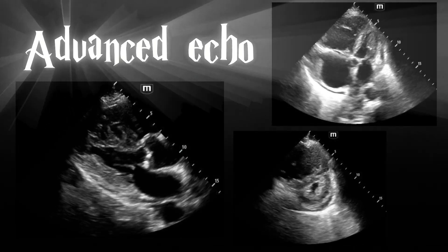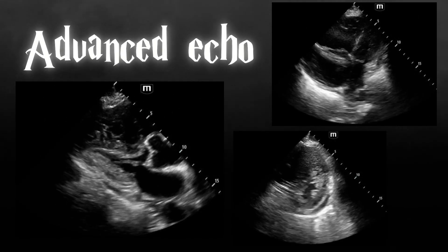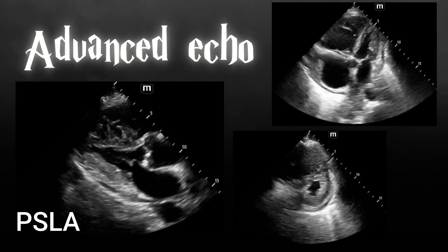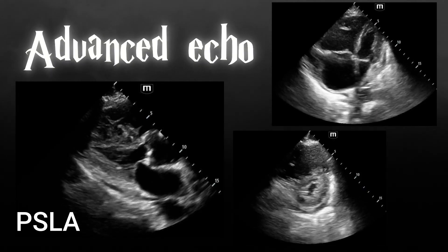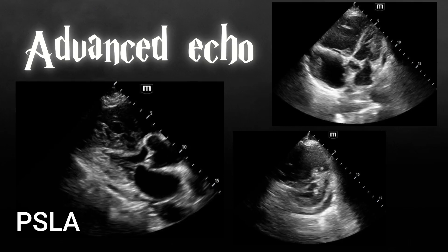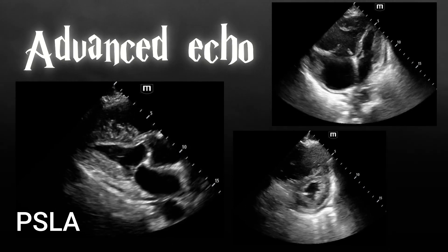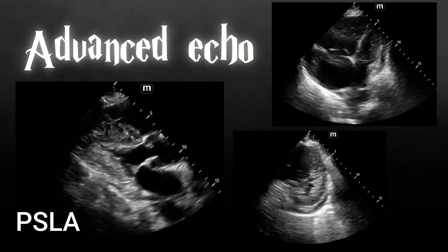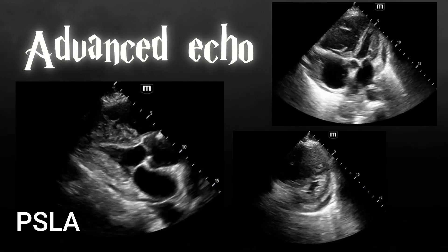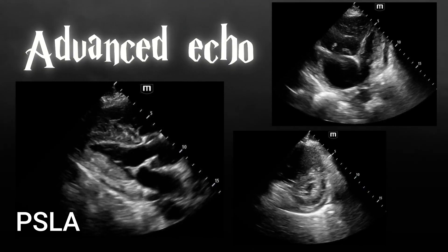Here are different views we obtained of the patient's heart. Starting on the left is the parasternal long axis view. You'll notice here that there is a trace pericardial effusion.